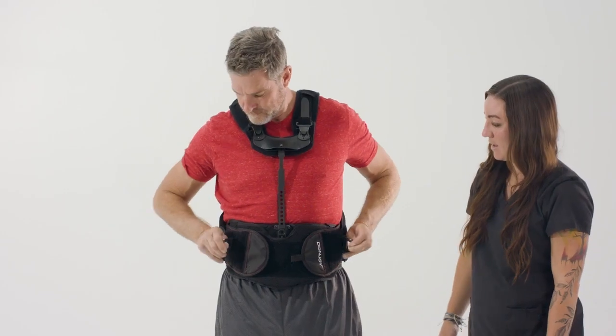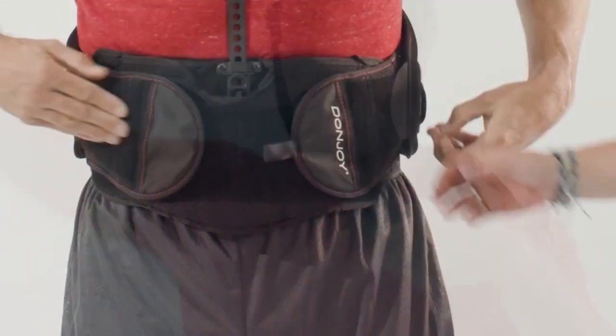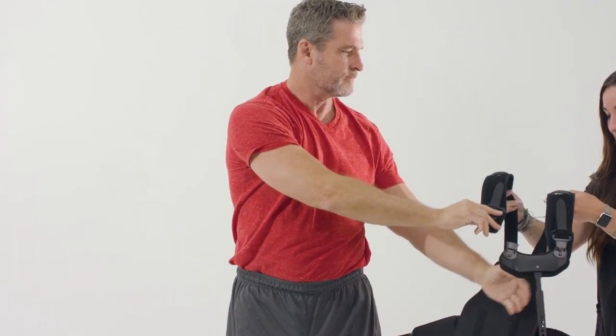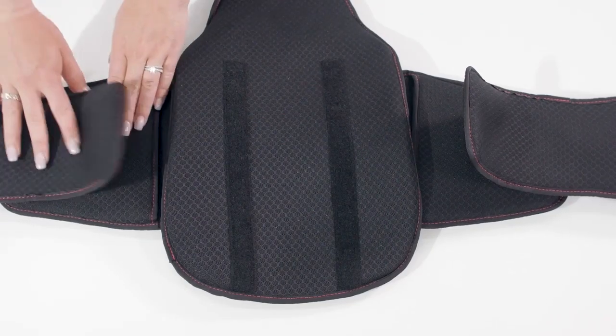To remove the brace, release the compression handles and remove one of the shoulder straps. Release one side of the side panel from the front panel, then slide the orthosis off the other shoulder like removing a jacket or a backpack. Customizing the TLSO should be performed only by a suitably trained professional.